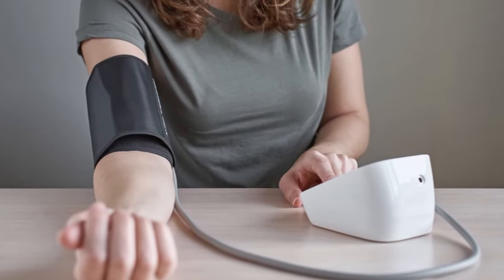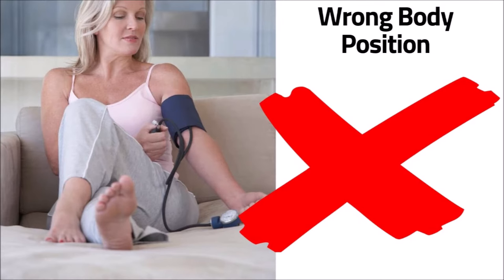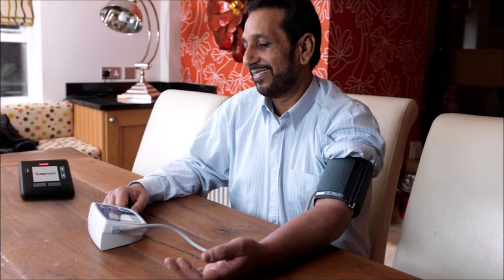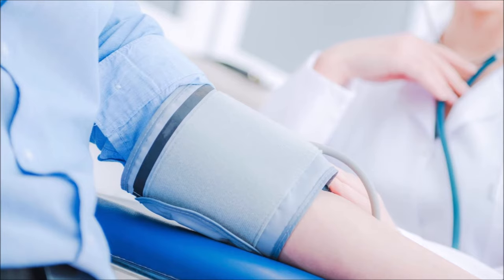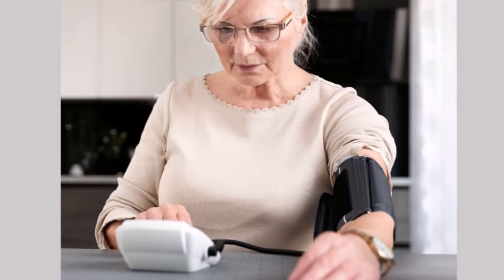First, to help with your correct arm position, your body needs to be in the correct position. You should be seated in an upright chair with back support. Your feet should be flat on the floor and your legs uncrossed. Your arms should be positioned outward from the body and supported either by an armrest, table, or similar support.